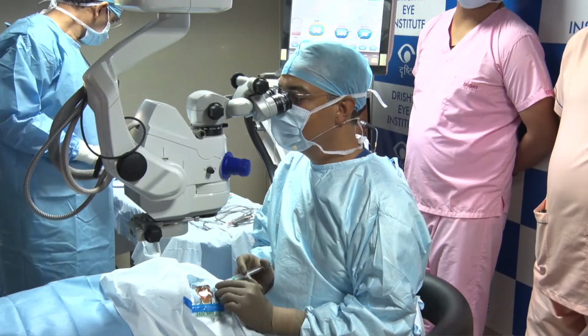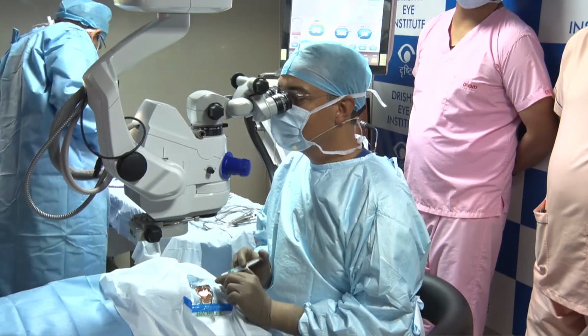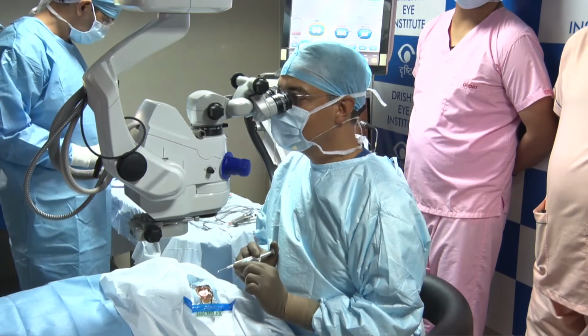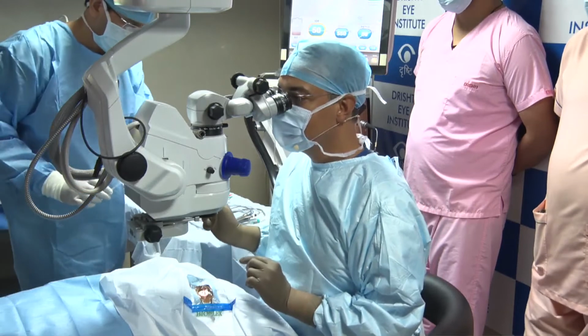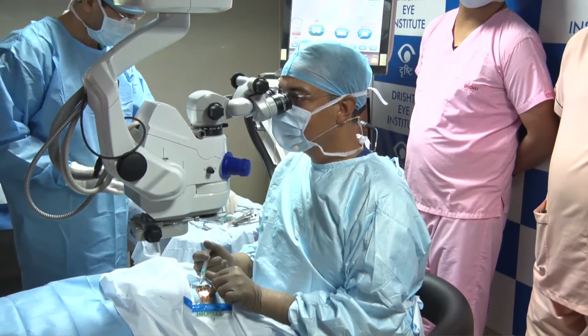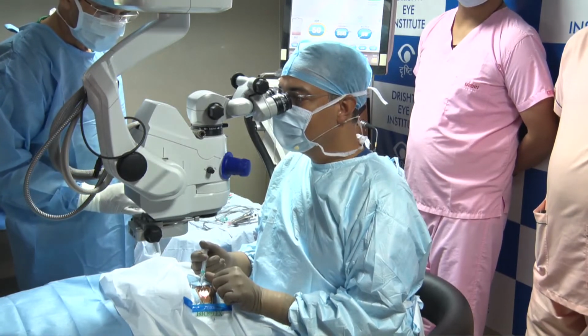Especially the wide range of sizes and vault with the IPCL, which we do not have with the ICL. With the ICL, we have very fixed kinds of sizes, 3 sizes or maximum 4 sizes. But with IPCL, I think you can order the size and get the customized size available for you. In terms of power as well, you have a bigger range of power with this lens, I think.